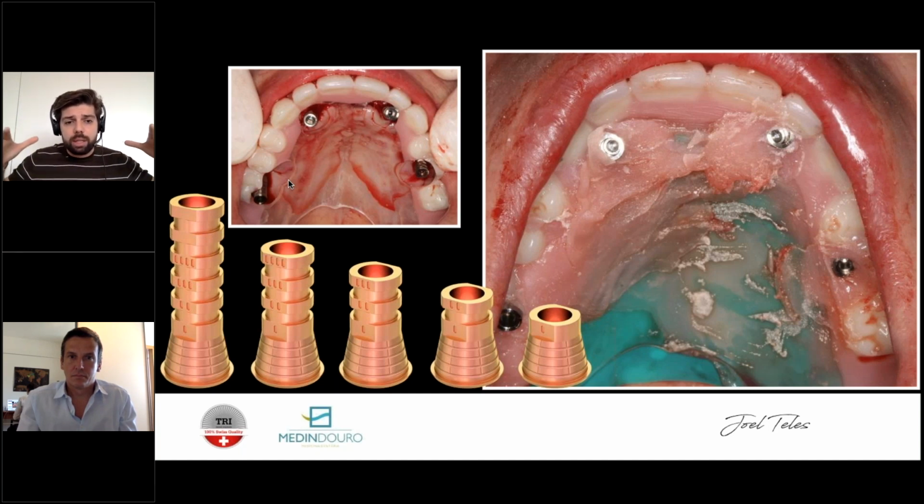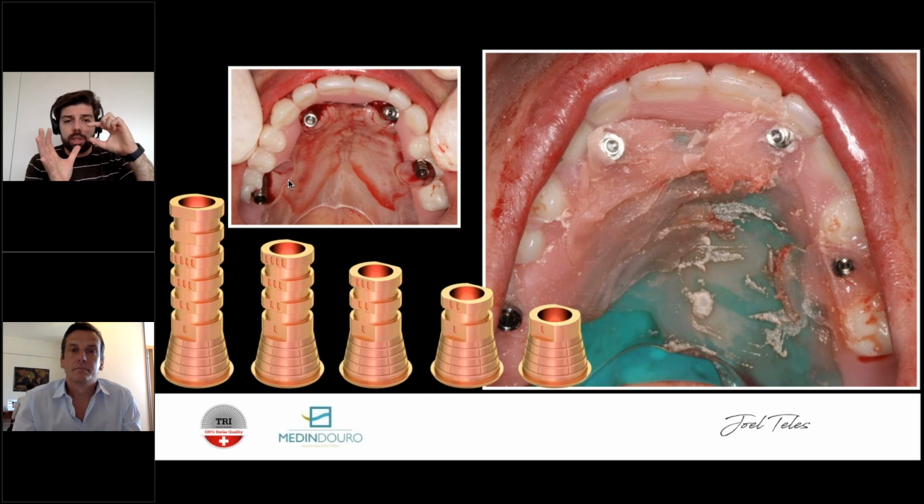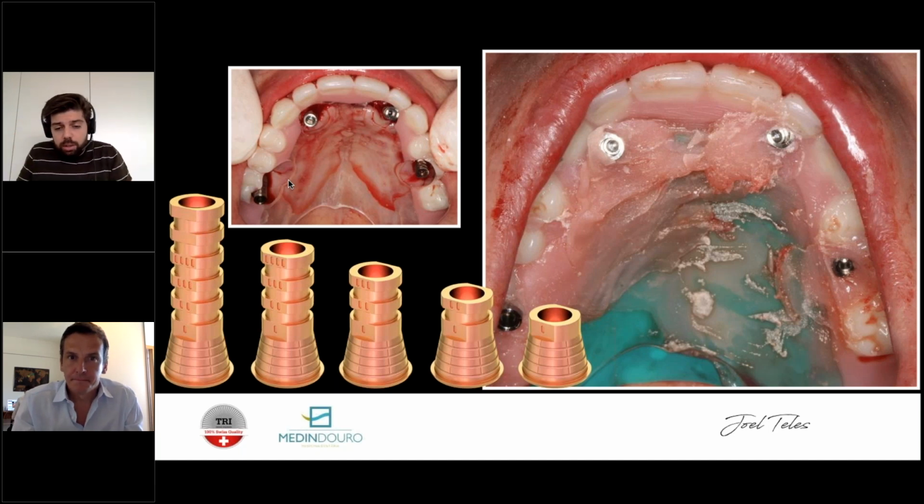This is a very big denture. It goes all the way to the tuberosities, all the way to the nasal spine here, and all the palatal is touching. So you can fit it in, and there's no doubt where its position is. So you put it in before you start the surgery, and you measure your prosthetic space. You know where the smile line of your patient is, and you draw the line there. And then that's it. There you know where your shelf needs to be created, even during the surgery, with this prepared, because, okay, you know this process very well at this moment.